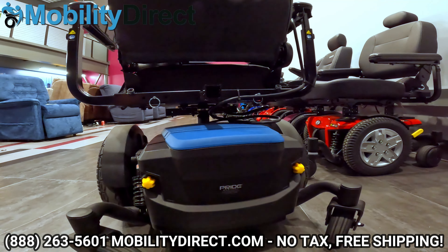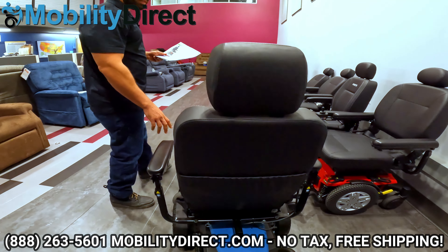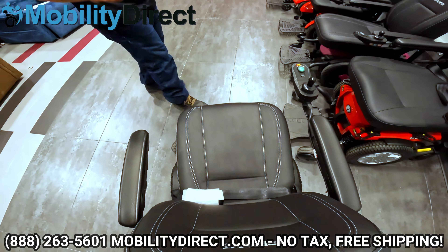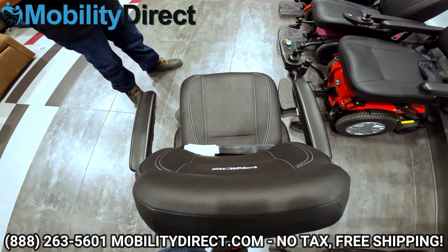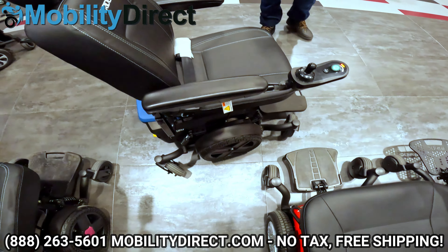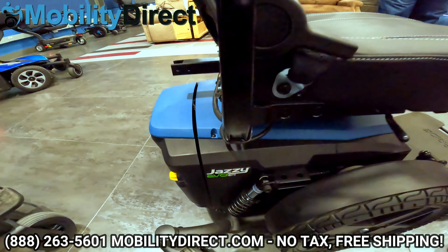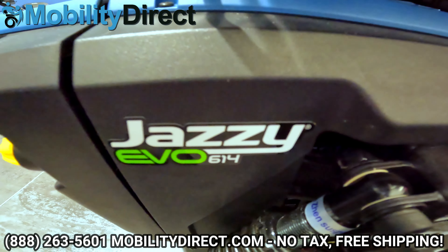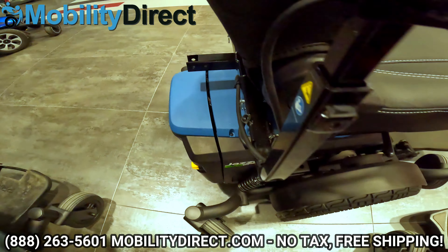It has an ultra comfort high back captain seat which has premium stitching with moisture wicking and anti-absorbent moisture technology. Really, really nice seat — I'm super impressed with the upgrade on the seats that Pride Mobility is offering on their power chairs now. It does have two 22 NF 12-volt lead acid batteries. The range varies depending on the load: with a 200 pound load it's going to get about 21 and a half miles, and if you're closer to the weight capacity limitation you're probably going to get around 18 to 19 miles. It comes with a 60 amp Lynx controller.